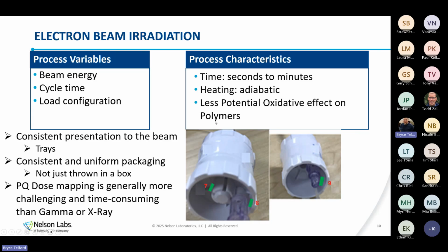So if I have an electron beam and let's say it's scanning from the top down, I have an area of low density, I have an area of medium density, and now I have an area of higher density. And that's all going to get different doses and shadowing. Same over here. I have a large area of low density because I have this big airspace, and then I have this area of high density. And depending on how I load this into the chamber is going to depend on how my dose is delivered.